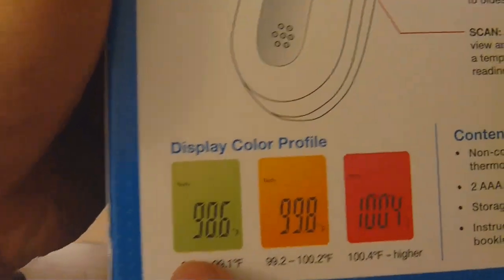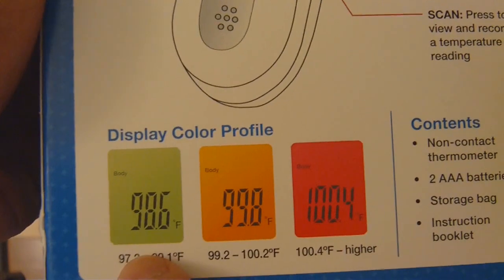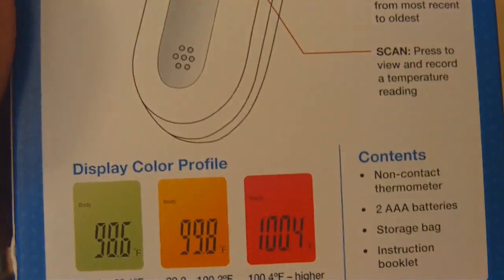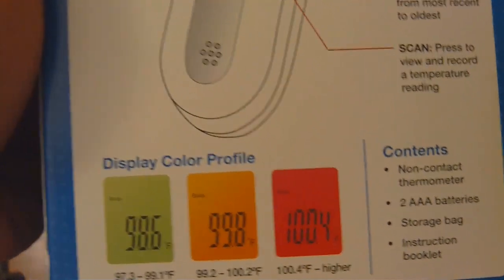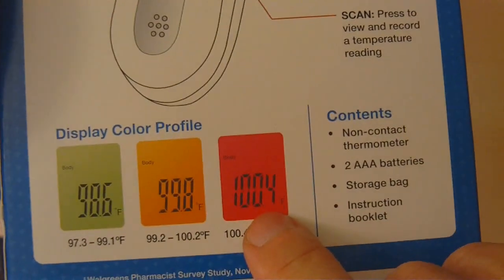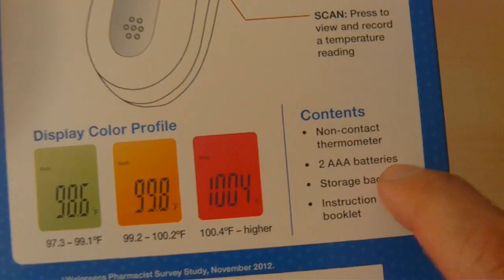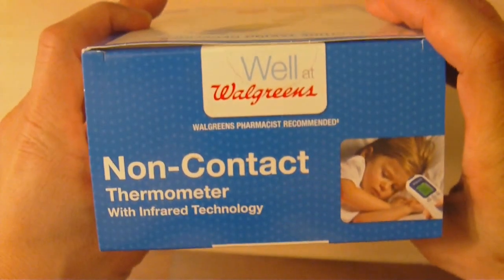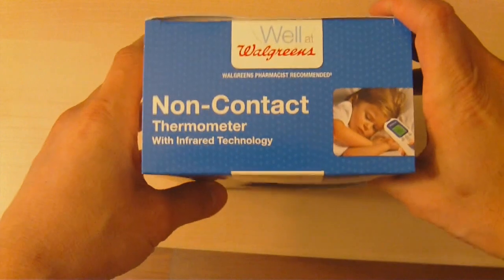98.6°F is normal temperature, and 99.8°F and above is a little high to very high if it's in the red code. The box includes a storage bag, instruction booklet, two AAA batteries, and it's non-contact.